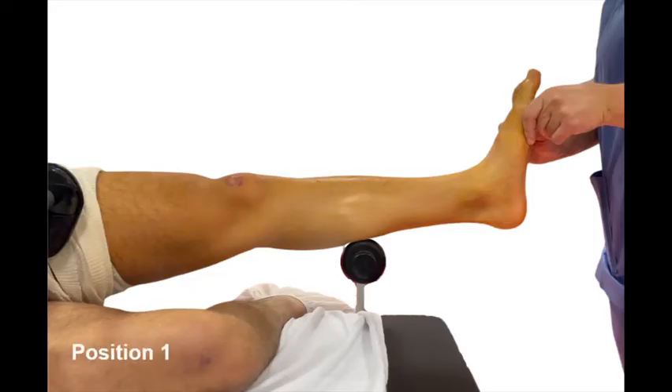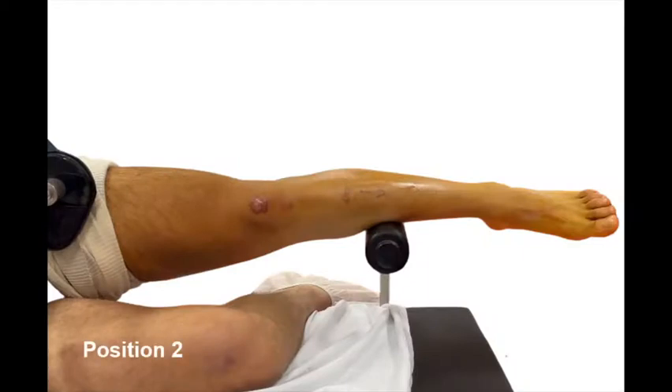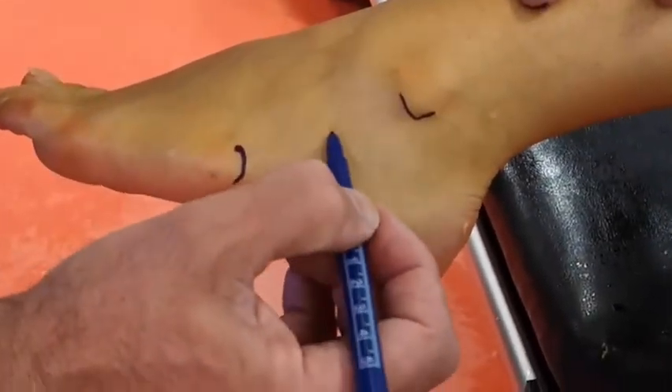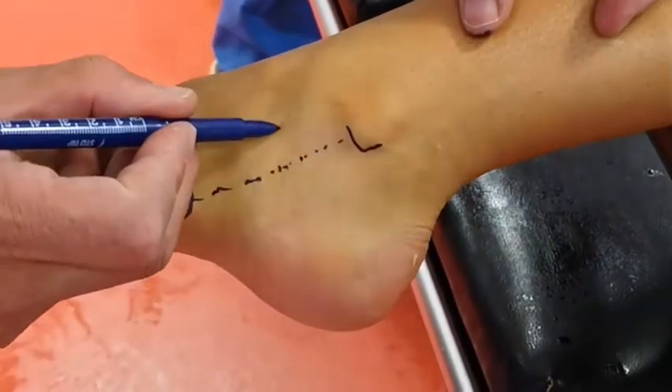The patient is placed in lateral decubitus with the hip externally rotated for position 1, used for anterior arthroscopy. An anteromedial portal located just medial to the tibialis tendon and an anterolateral portal are used. Lateral endoscopy is performed with the hip in neutral rotation. The endoscopic portal is located 2 cm anterior-superiorly to the midpoint between the base of the 5th metatarsal and the tip of the fibula.